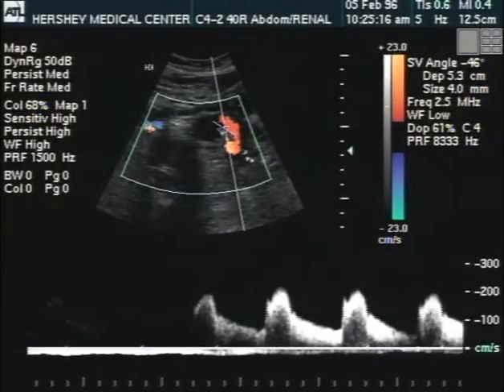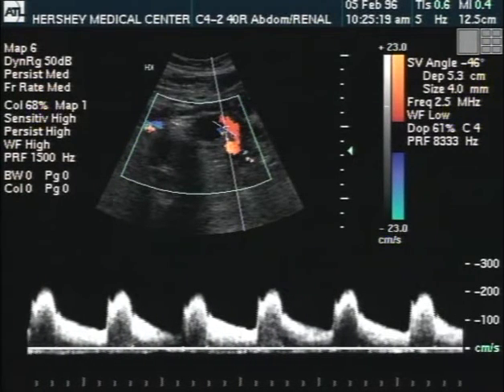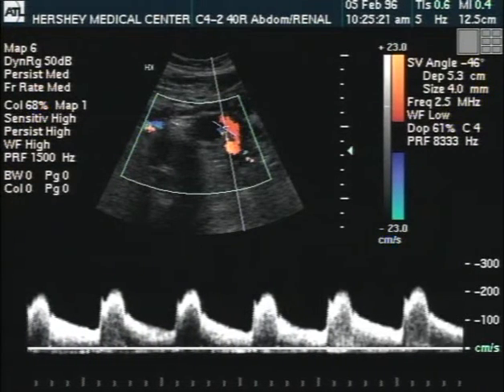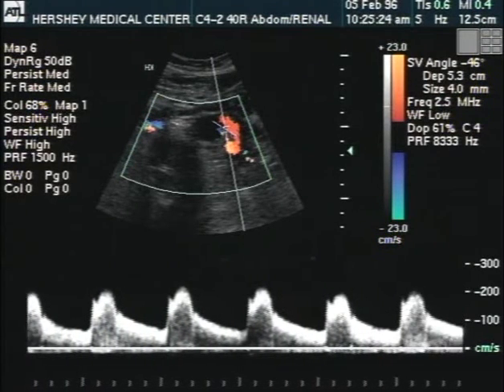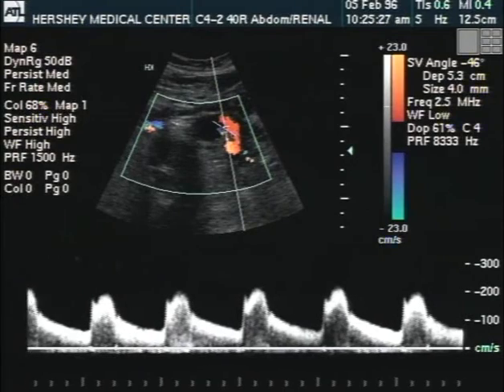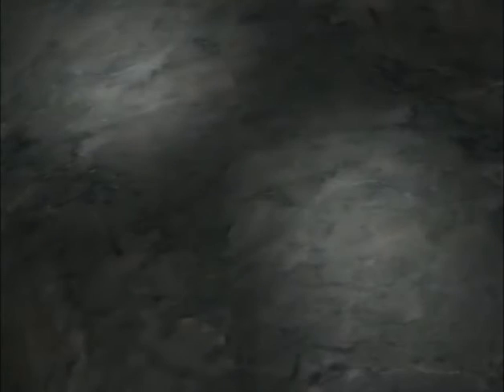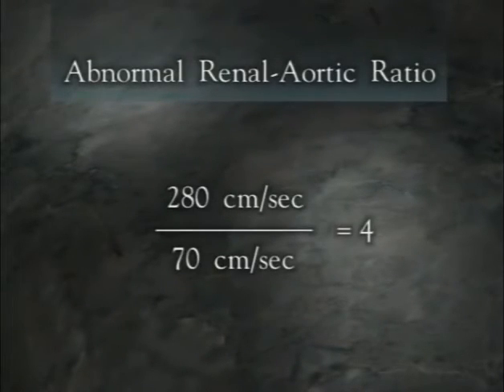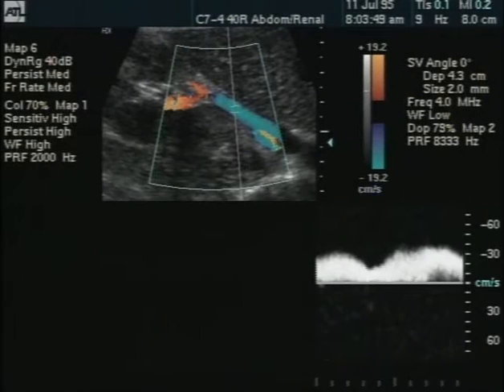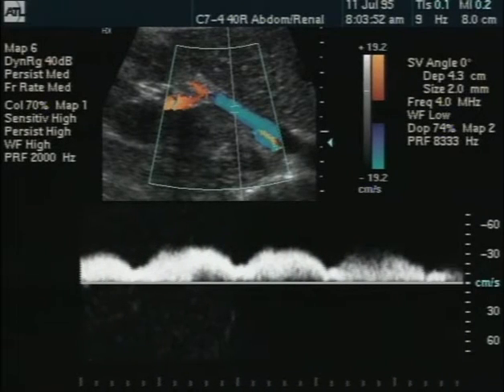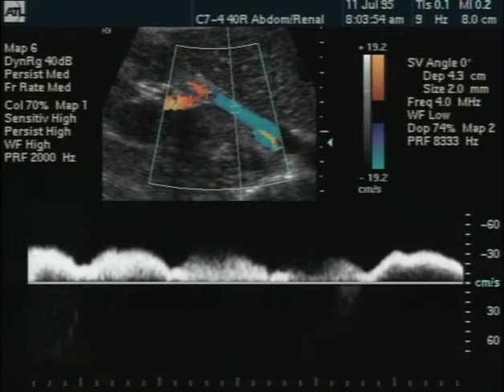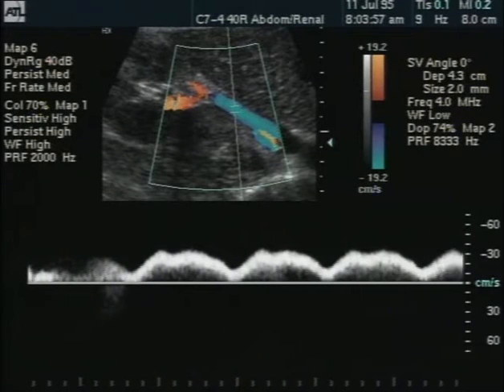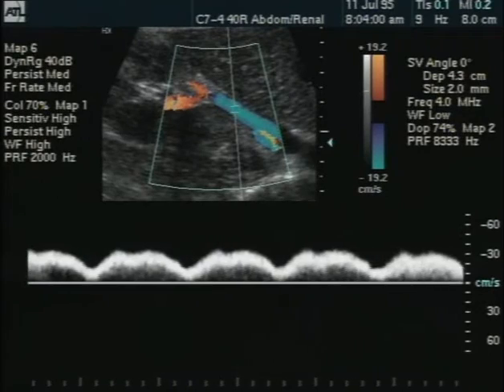When stenosis narrows the renal arteries by more than 60 percent of their diameter, the velocity will increase in peak systole, becoming much higher than the peak systolic aortic velocity. In this setting, the peak systolic renal artery velocity divided by the peak systolic aortic velocity will result in a ratio of velocities greater than 3.5. The spectral waveforms from the normal renal vein demonstrate respiratory phasicity, characteristic of the peripheral veins, and color flow imaging will confirm the phasic nature of the venous flow pattern.